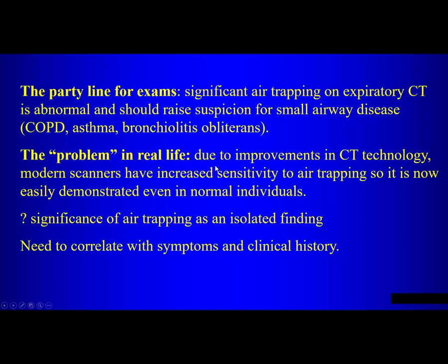But in real life, because CT can be very sensitive, air trapping as an isolated finding can be problematic. So you need to correlate with symptoms and clinical history. So just because I see air trapping in a normal patient or in a patient on a CT scan does not mean that that is pathologic. So you have to remember that.